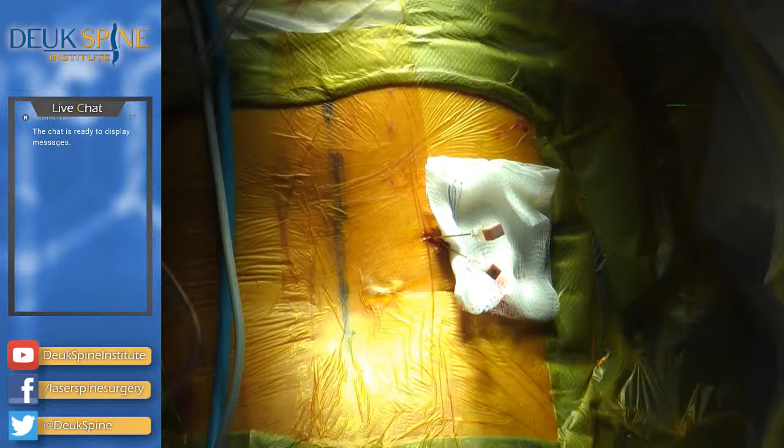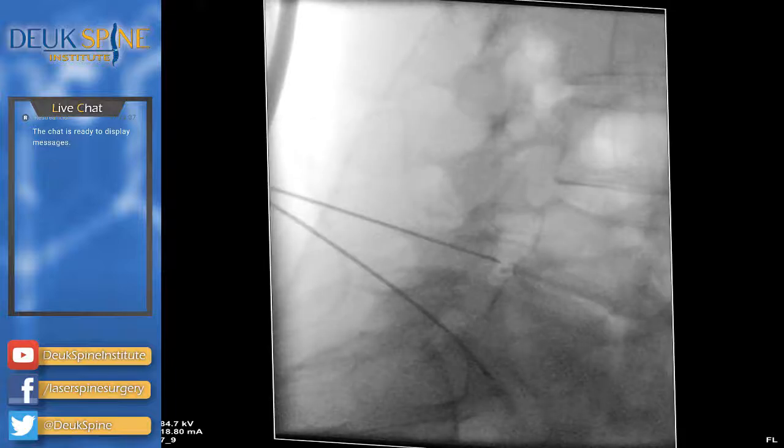I want you to really get in on that 4-5 disc. One more time. Let's see if we can get those pedicles slightly better. I honestly think that looks pretty darn good, but see if we can get those pedicles slightly better. I'd say a degree of wag one way or the other. I don't know, I think that's worse. Try the other way.